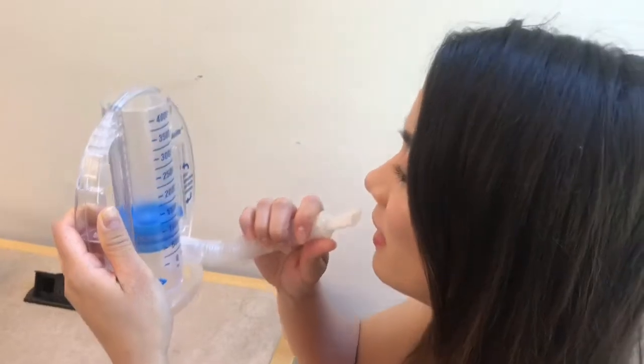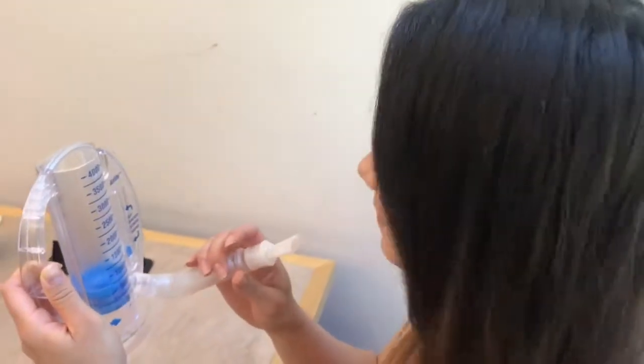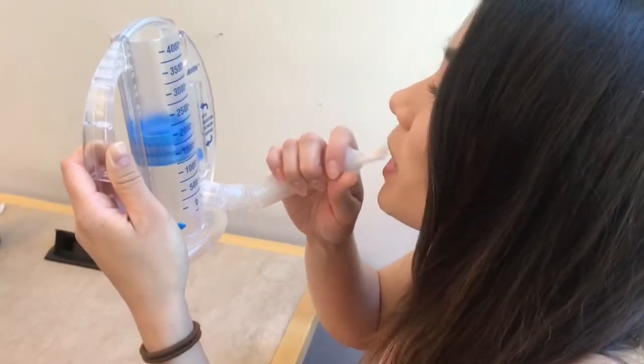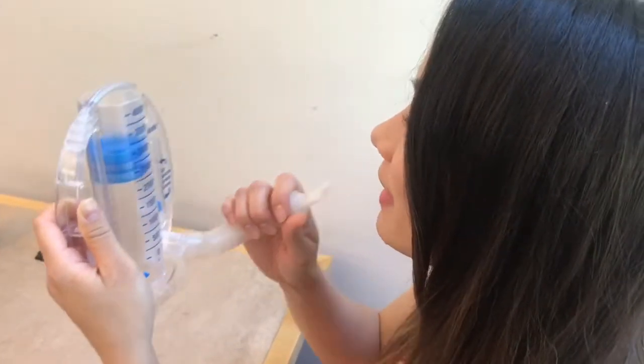But then they do that and they keep going, thinking they're doing good — but they're not. The indicator has to stay in between the lines, and it has to be one deep breath at a time. Those are the simple tips you have to educate them on as a nurse.